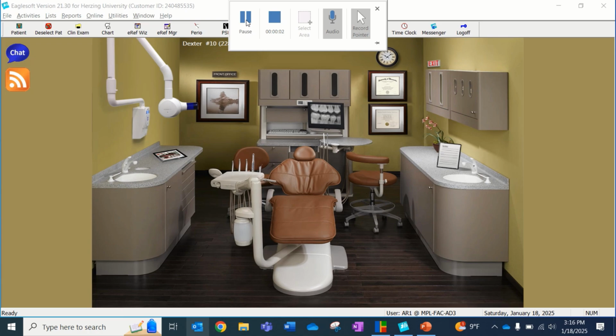Hi class, here is a short little demonstration on how to fill out your periodontal probing chart.